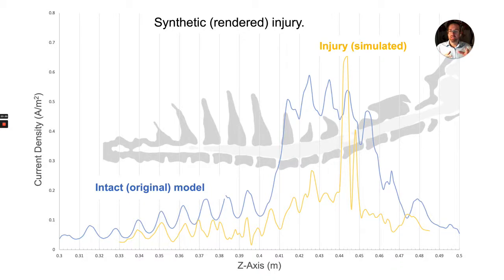And so while we saw this in the rodent, it is much more dramatic when we're going to the scale of the cat. And this has, I think, important implications to what we think would happen in people, and more general implications to this notion that, for many reasons, using larger animals can be a powerful tool to develop translational treatments. But here I'm showing you specifically, they may be a more powerful tool to develop neurorehabilitation treatments, because the current flow patterns that we get may start to be more analogous to what we see in people.